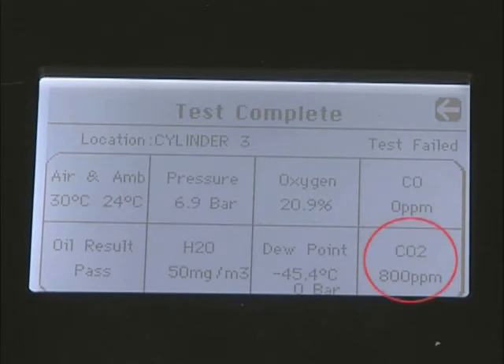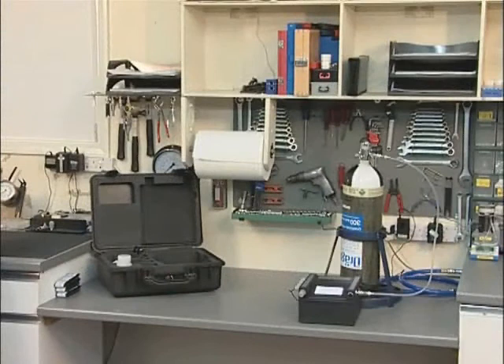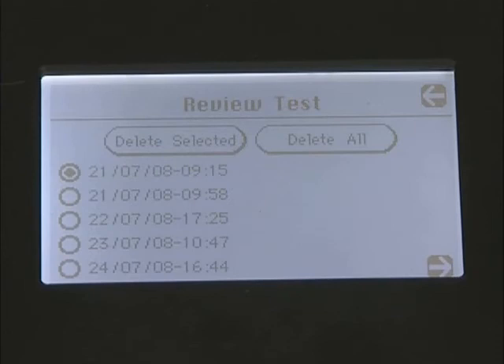If the test was a fail, flashing asterisks would indicate those criteria which did not meet the standard. The F4001 and F4001ED automatically determine, from the water content measured, whether the test was a pass or fail against the standard, and also calculate the atmospheric pressure dew point. This test result is automatically recorded in the instrument's memory, which can store up to 10 previous tests. To view these tests, return to the main menu and press the Review Tests button. Test results are stored according to the date and time they were completed, and previous tests can be viewed or deleted as required.